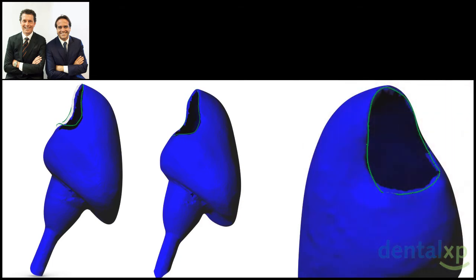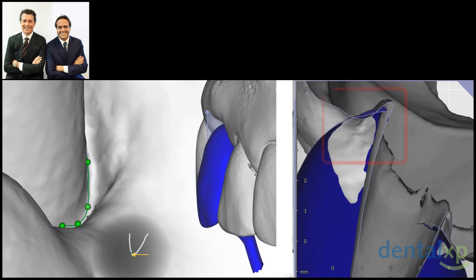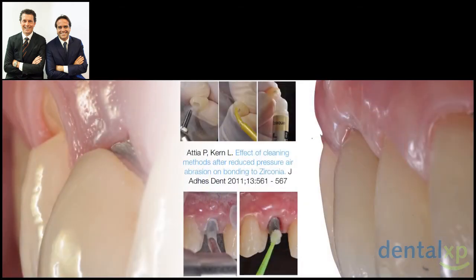Here you see how the details can be copied in a digital way, especially the details that are the most interesting from our point of view in this kind of restoration, which is the emergence profile, which is supporting the soft tissue. Of course, we need to have a scanner which reads in depth in the sulcus in order to give this valuable information to our dental technician, in order to exactly copy and paste the emergence profile of the provisional restoration, which was already tested in the patient's mouth, duplicating it in the exact same way for the final restoration, without any model, because in this case we decided to go with a monolithic zirconia rehabilitation. And here, the before and after.